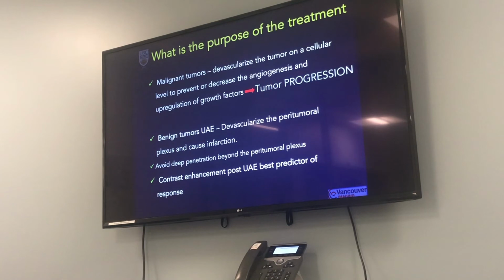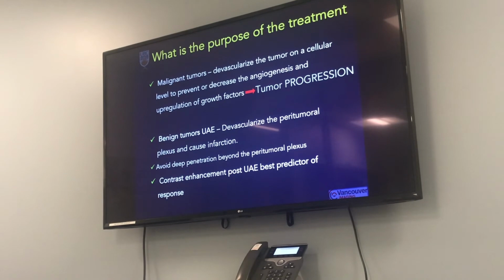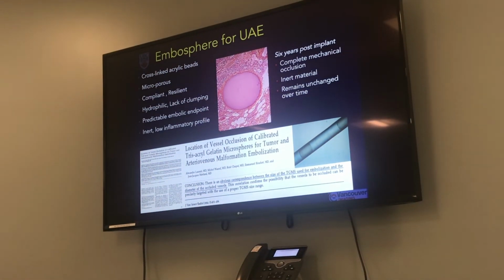So the pain that these patients get is not because their uterus has infarcted, it's because the fibroid is infarcting. The myometrium is still getting blood supply. It's not that the myometrium itself is a problem. So that pain that the patients experience, it's an ischemic pain related to the embolization of the fibroid. And that ischemic pain can be really bad, as you all know. It can be very unpredictable and very difficult to control. And again, we'll talk about that in a little bit. So we use Embospheres.